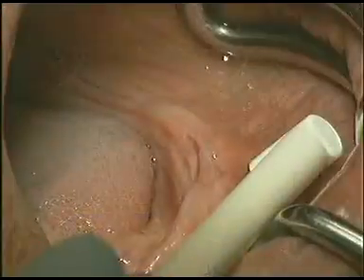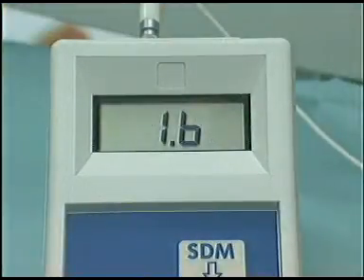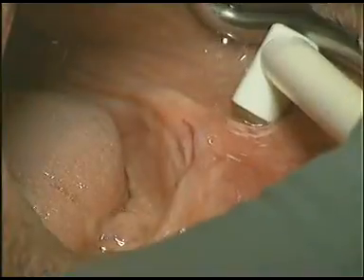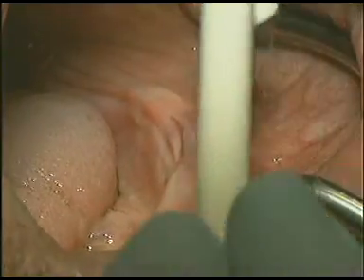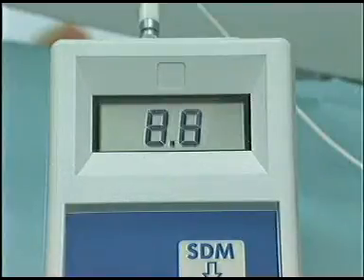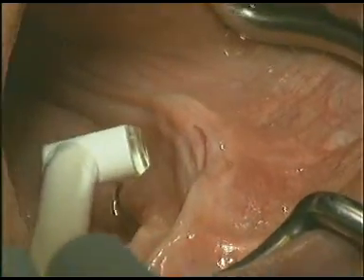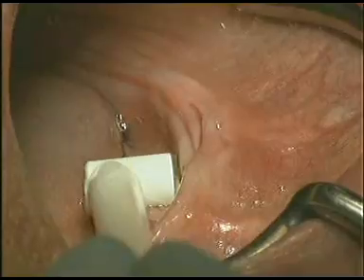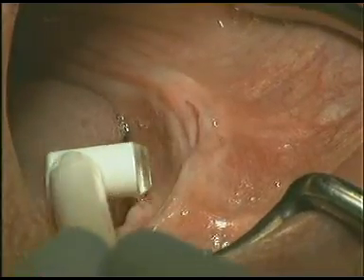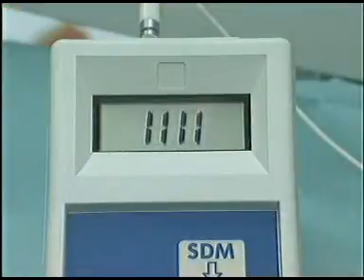A piezoelectric crystal emits ultrasonic impulses, which are transmitted through the mucosa and reflected off the bone surface. The period which elapses between transmitting the impulse and receiving the echo is recorded to calculate the thickness of the mucosa and display it in fractions of a millimeter. These figures are also transferred to a sectioned model for visualization. The measurements and definition are accurate to within 0.1 of a millimeter.